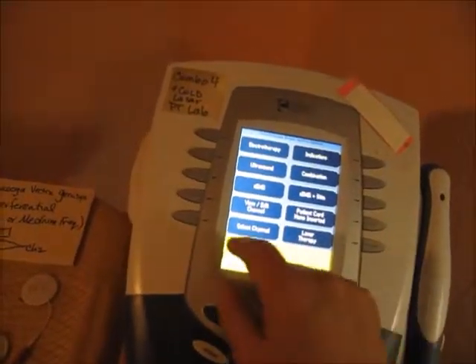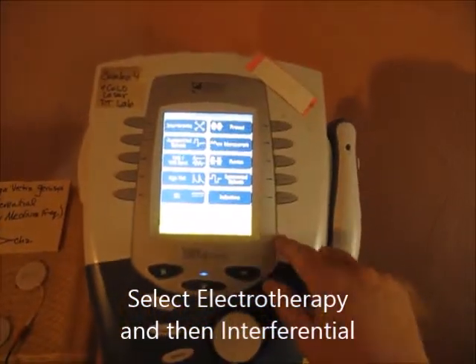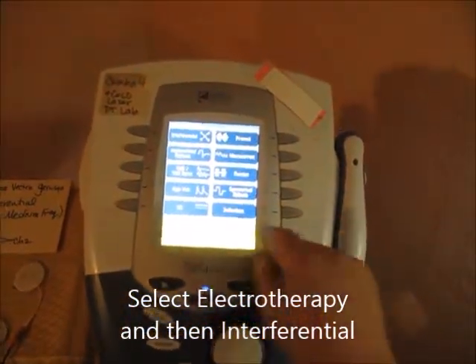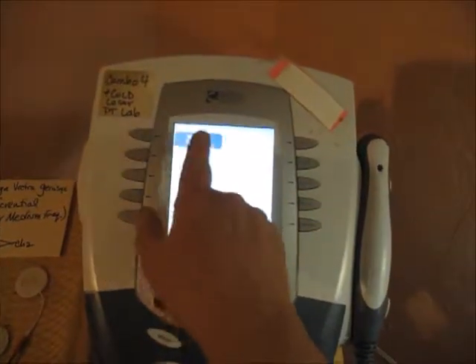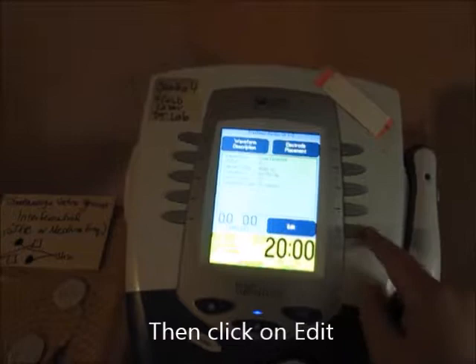What you need to do is choose Electrotherapy and then choose the Interferential button. Don't choose those other options — just choose the Edit button and it goes right to it.